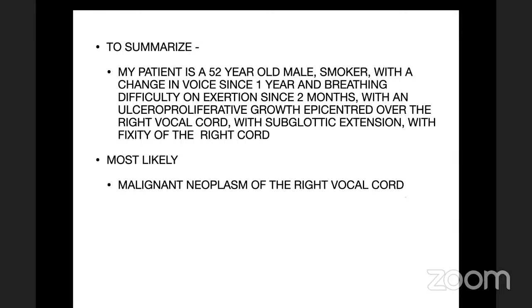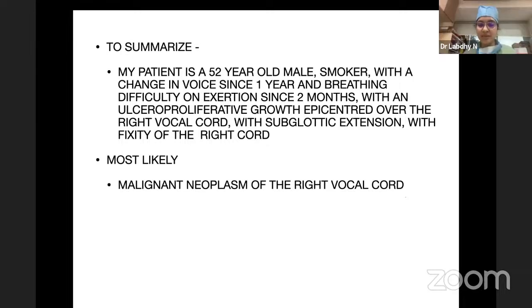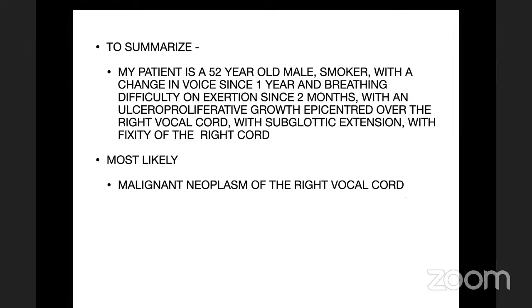It is less sensitive. It is seen only in up to 42 or 44% of the patients. So we can't rely just on extralaryngeal spread. What are the MRI criteria and who gave these criteria?